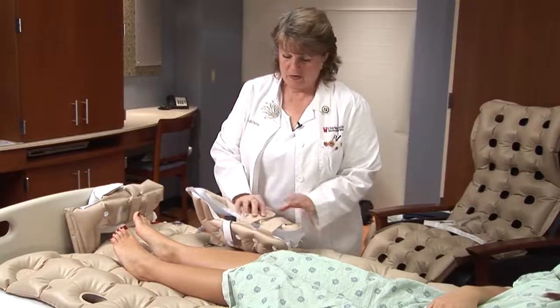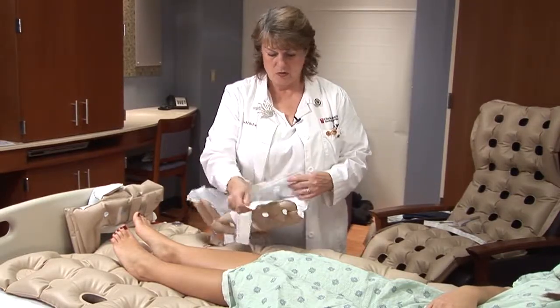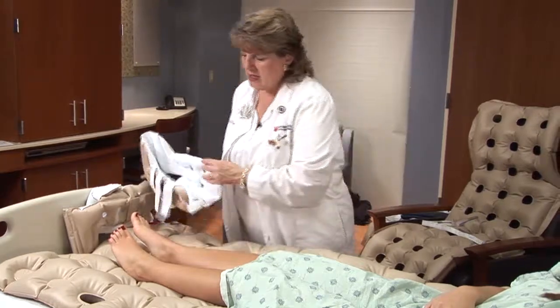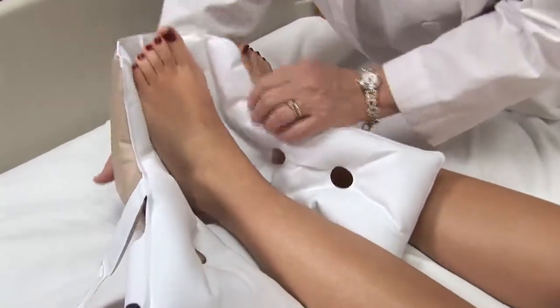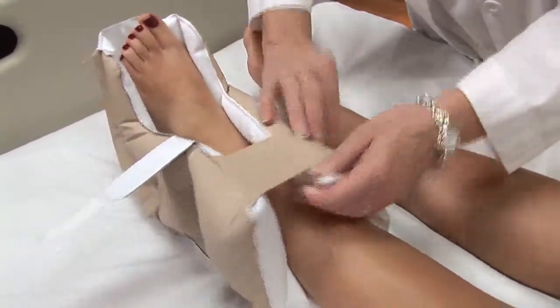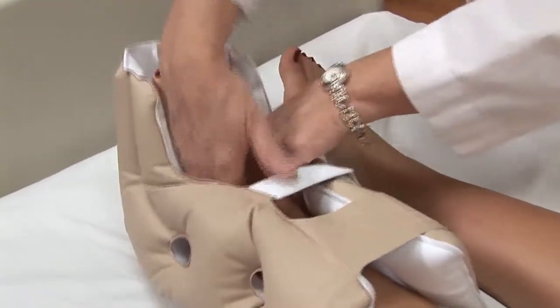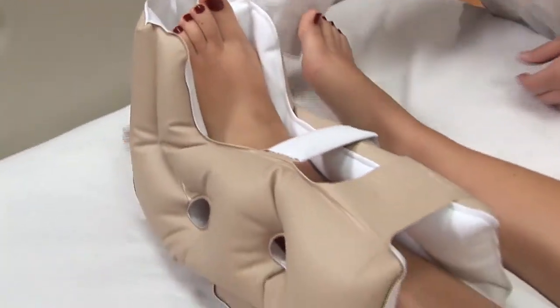When I put these on you, there are straps to hold it in place so your legs won't shift. There's a cotton lining on the inside that usually feels pretty cool to the foot. Drop your foot in here. Make sure that the heel is still floating off of the mattress for pressure ulcer prevention.